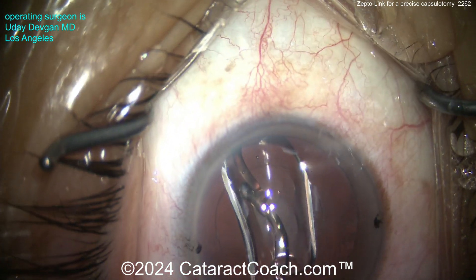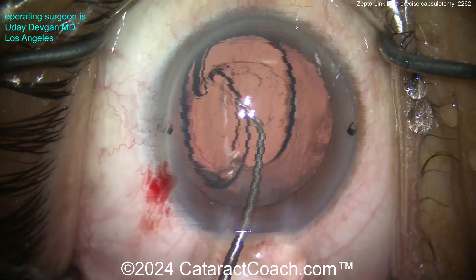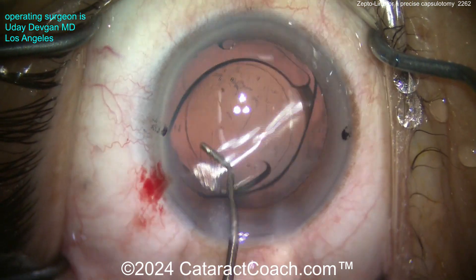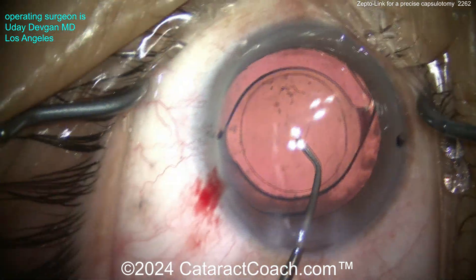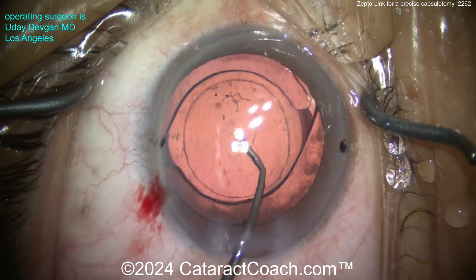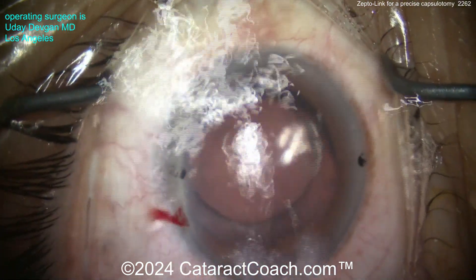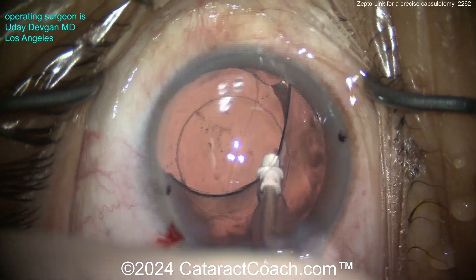Here comes the IOL — I'm going to place it in the capsular bag. This patient is getting a toric monofocal. The arms open up — there's the toric monofocal lens. Now look at that capsulotomy opening: you know that's a six-millimeter optic — the capsular opening is 5.2 millimeters. Look how pretty that looks — fantastic outcome.